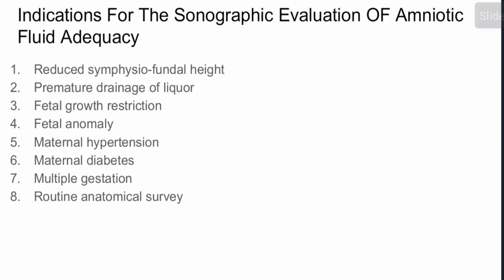Now, why would a sonographer, sonologist, radiologist, as the case may be, decide to have an objective assessment of the amniotic fluid volume, of how adequate the amniotic fluid is in an ongoing pregnancy?